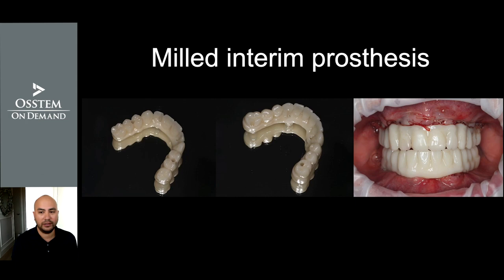This is a case that I've done recently. The only issue in this case is that it could take several hours to mill an interim prosthesis. So it means that the device could usually be fitted on the next day.